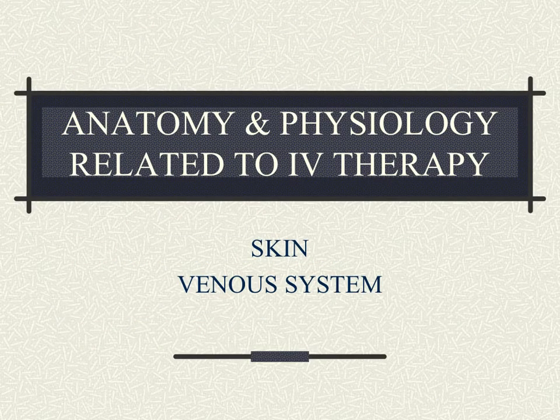In order to place peripheral intravenous catheters with the goal of providing positive vascular access outcomes, you must understand the anatomy and physiology of the skin and venous system and be familiar with the physiological responses of veins to heat, cold, and stress. It is also important that you become familiar with the skin thickness and consistency of various sites to perform venous access proficiently.